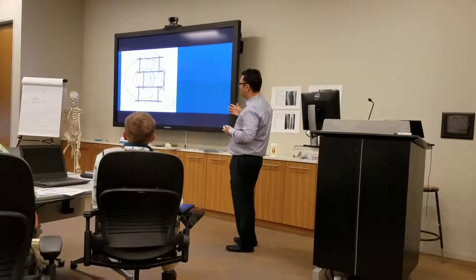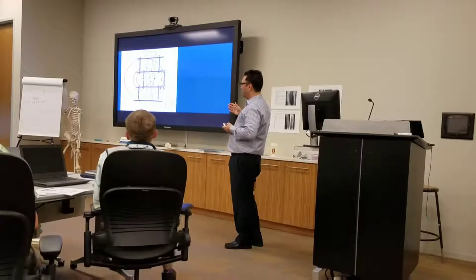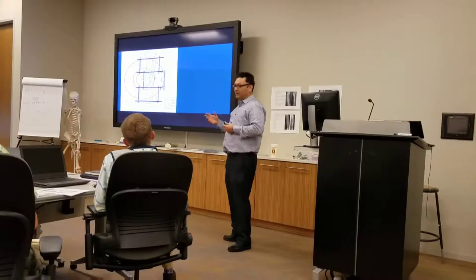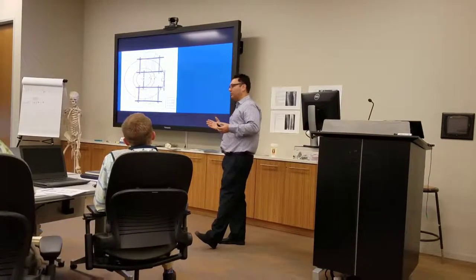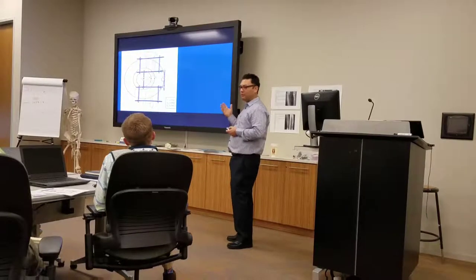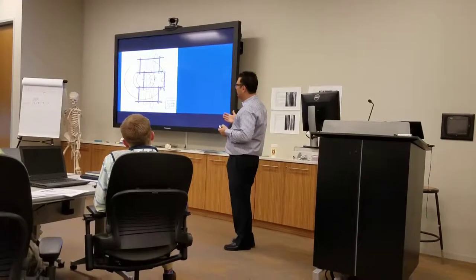That's called similar triangles. This is called concentric circles. This is a formula that you can see in Paley and Herzenberg's book as well, when you're trying to figure out rate of correction. Now, this is where you have to be really thankful for the systems available today, because they're doing all that math for you. But it's good to know the basics of the old formulas, so that you have an idea of how we got from point A to point B.